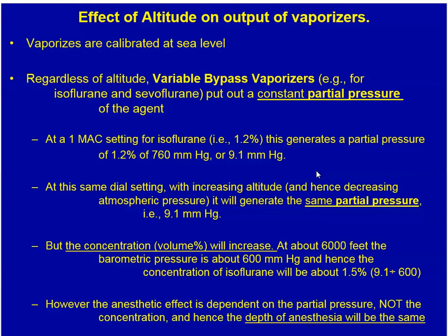However, remember that the anesthetic effect is dependent on the partial pressure, not on the concentration, and hence the depth of anesthesia will be the same, even though the percent concentration coming out of the vaporizer will be higher. That is because the partial pressure will be nominal.